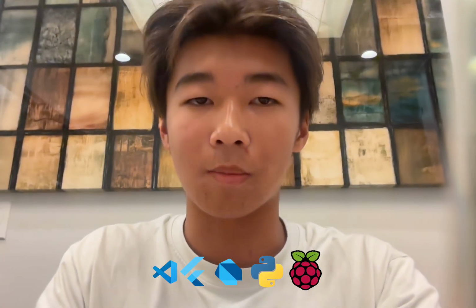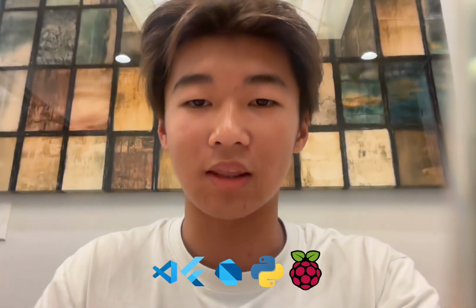for them. The app was built in VS Code using Flutter and the Dart programming language, and it connects to a Raspberry Pi chip that runs Python to process data from pulse sensors and accelerometers. The app is also connected to a Firebase database. I will now be demonstrating the app itself.